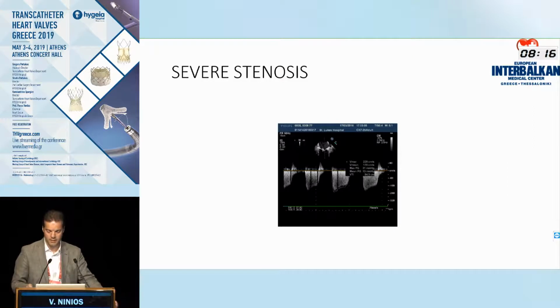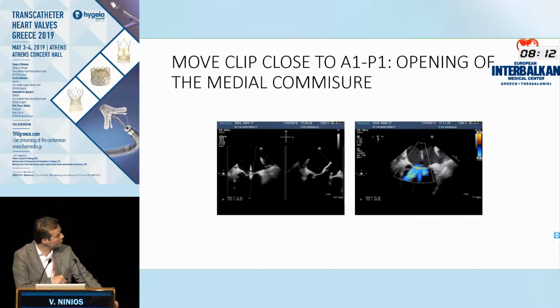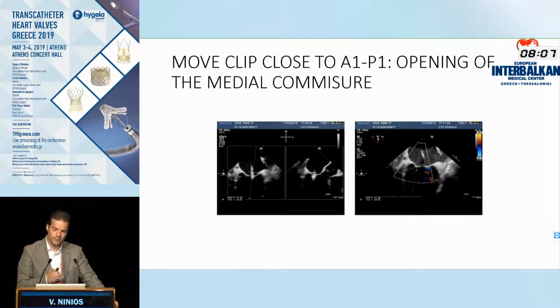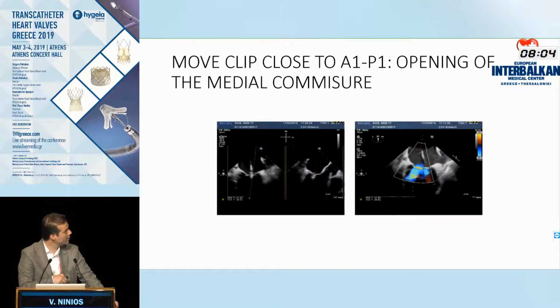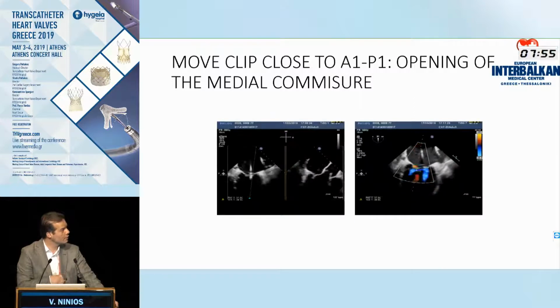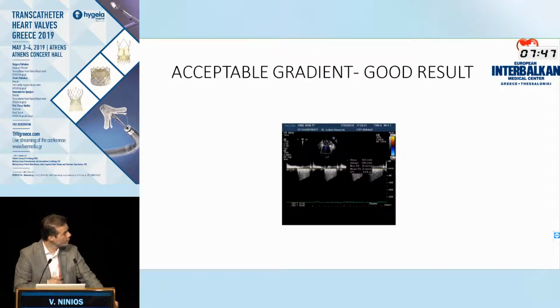So we opened up the mitral clip, and we thought, okay, let's move this clip as far laterally as possible, because we saw on the 3D that the medial commissure was opening okay, and the lateral commissure was fused, so there was a hidden rheumatic disease there. So when we put that, we had an acceptable result in terms of reducing mitral regurgitation. We still had a lot of spontaneous echo contrast. That is something we expect because we reduced the backflow of the mitral, but we had an acceptable gradient. And this patient is now almost 3 years out, and he's doing very well.